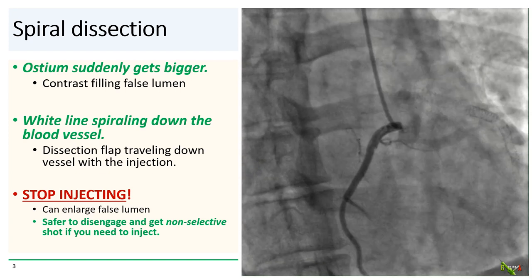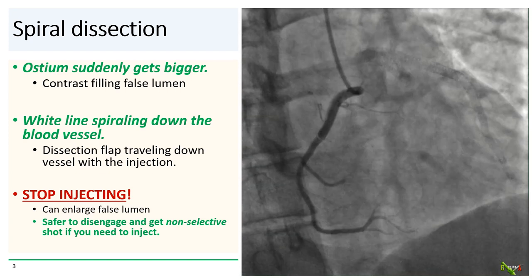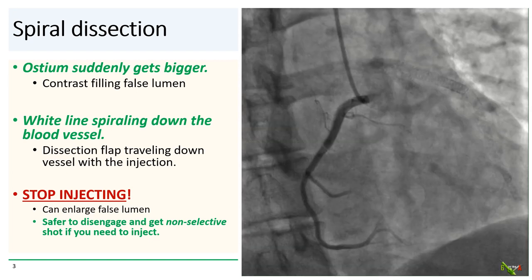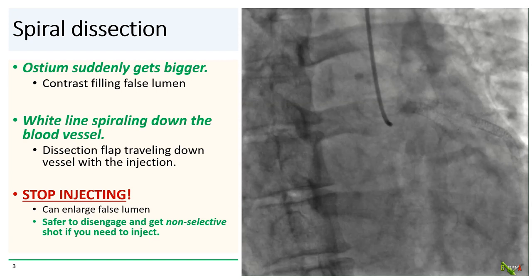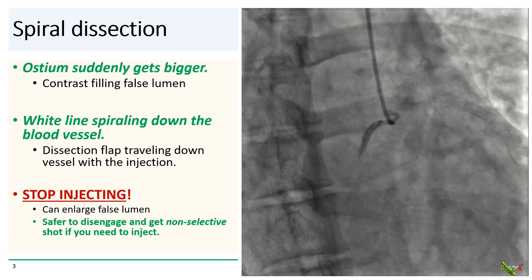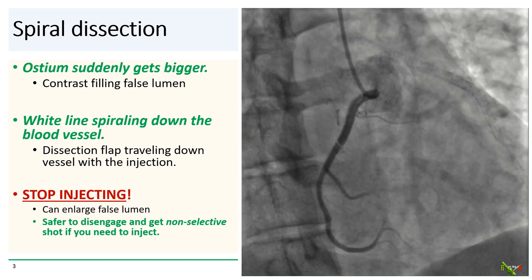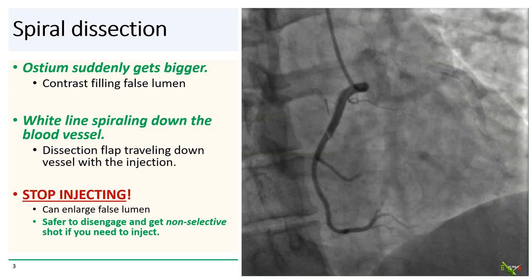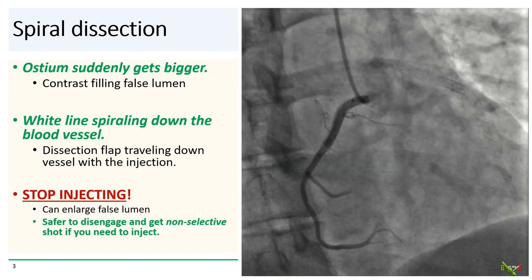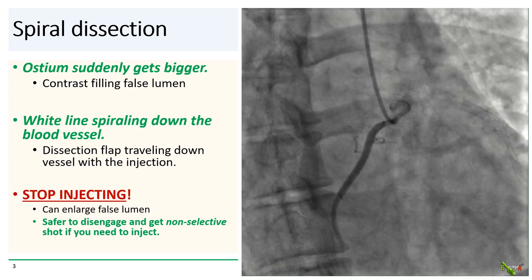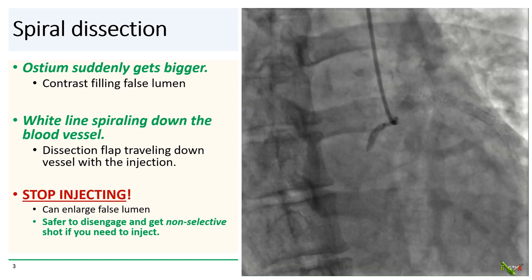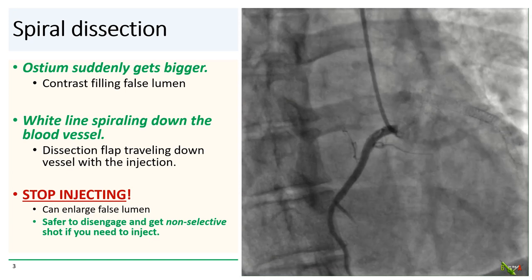The first thing you do is stop the contrast injection. Contrast injection can continue to enlarge the false lumen. Avoid injection if you can, and if you must inject to see where your wire is going, it is safer to disengage your catheter and get non-selective shots, although obviously the image quality is going to suffer.